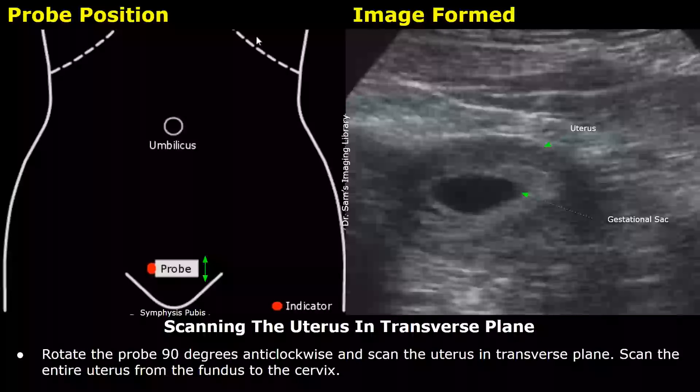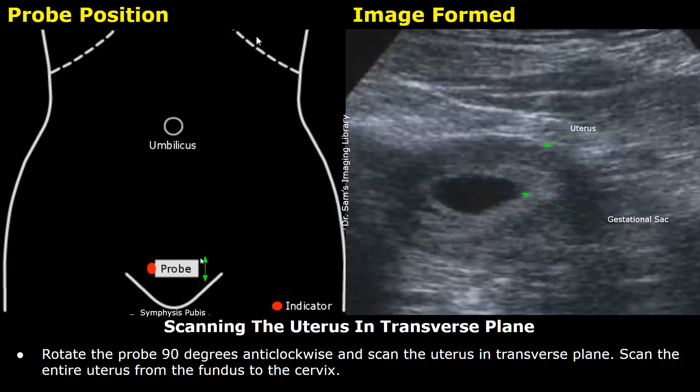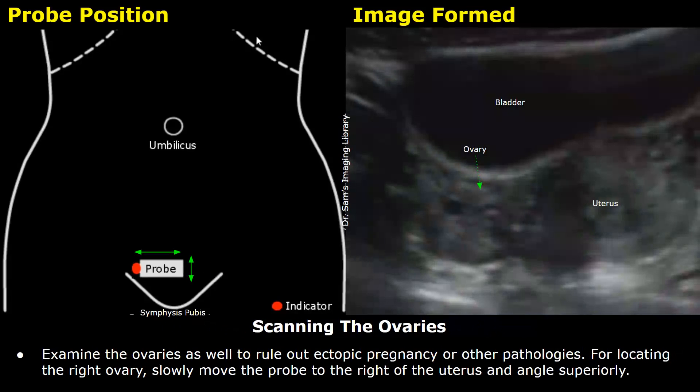After that, you can rotate the probe 90 degrees anticlockwise from the longitudinal position to scan the uterus in the transverse plane. Scan the entire uterus from the fundus to the cervix. Check for any other pathologies or ectopic pregnancy. Examine the ovaries as well to rule out ectopic pregnancy or other pathologies.